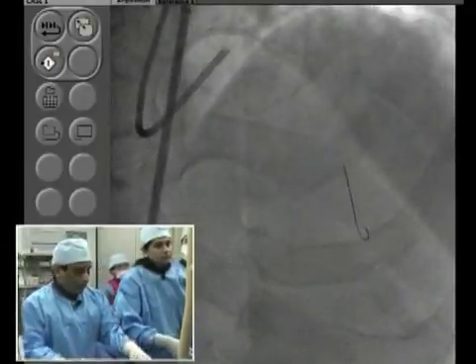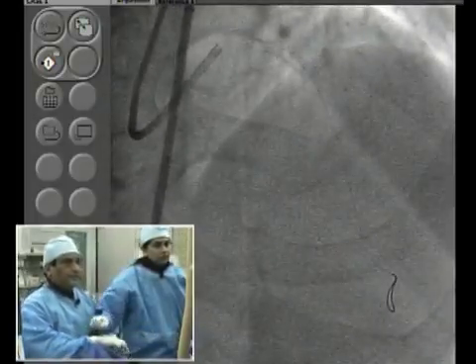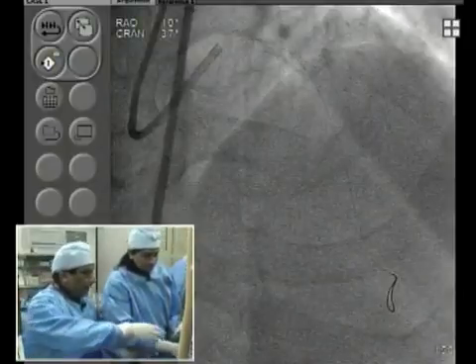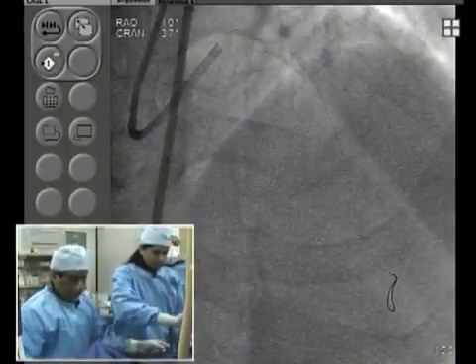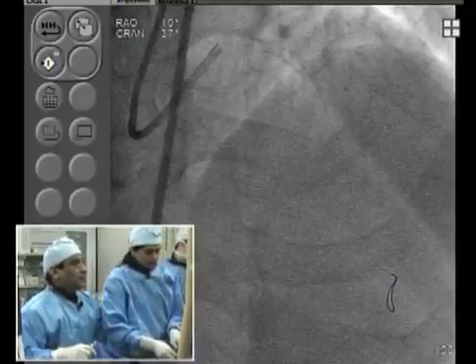This patient developed a lot of EKG changes, but not surprising, and this is part of why we are going to give a little verapamil, because of microembolization probably with that extensive burring, not unexpected.